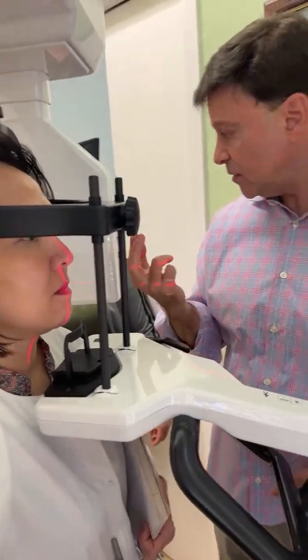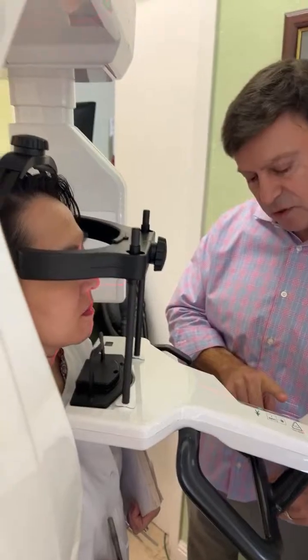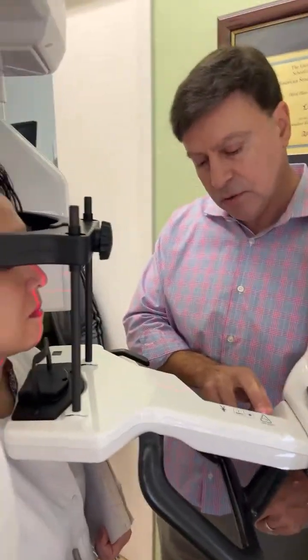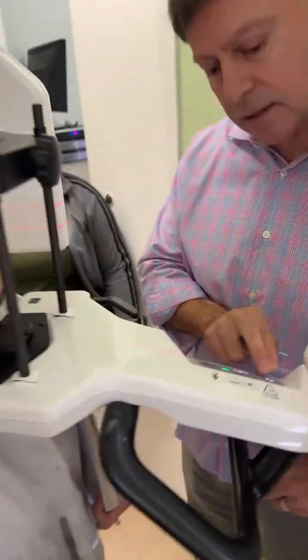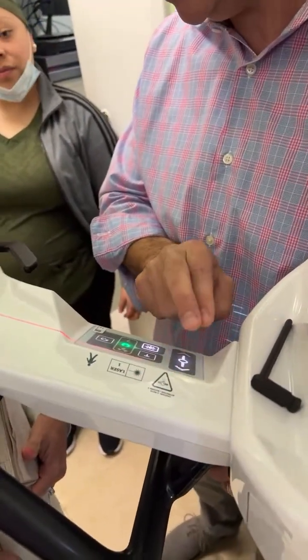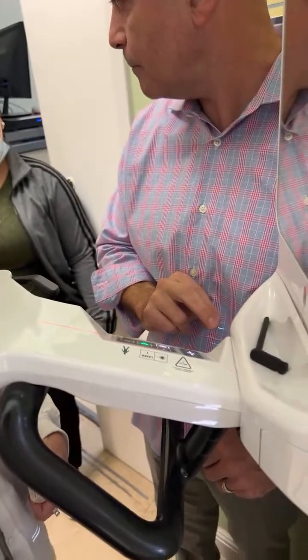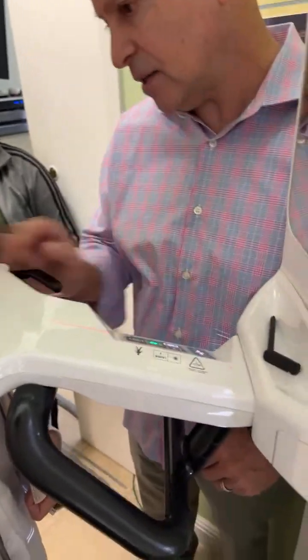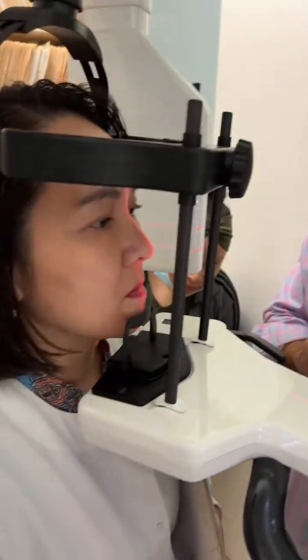So I use 2 fingers, a little more surface area on this. If you use 1, it doesn't move as responsive. So I would use 2. And if you move it by swiping like this, like I'm doing very slow, it'll go a few millimeters at a time. If you hold it, it'll go much faster. So you don't want to do that with the patient. So right now you can see all this space under her chin.